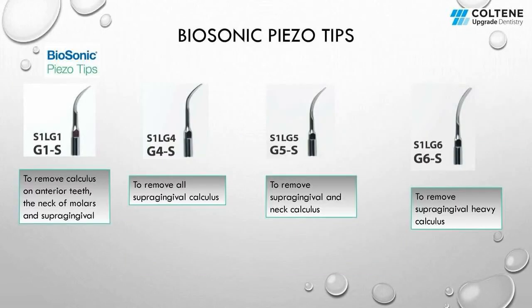So these are the tips that are available with the device, and you can see there are different indications for different types of tips, and I have already generalized the tips in a different slide, so you can easily understand just by looking at the tip how you have to use it and at what power you have to use it so as to achieve optimal results.